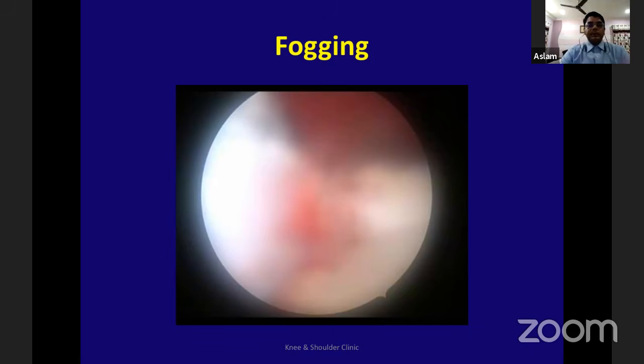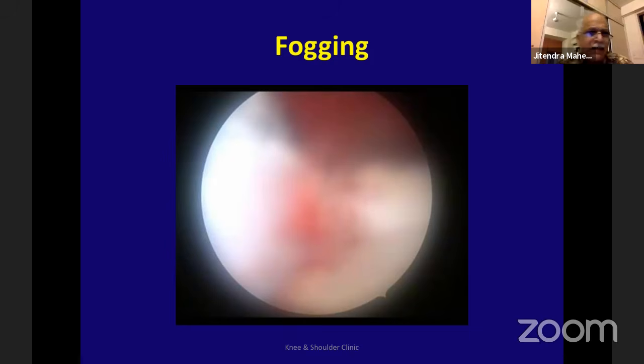The other part is about the locked meniscus. Once there is a locked meniscus, it does obstruct because sometimes there is a flexion deformity of 10, 15 degrees. When you know there is a locked meniscus, you can make your initial portal slightly higher. If it is a medial meniscus, it doesn't need any change; you can go through the same portal, except that when you enter, you will not see what you're expecting. You will not see the medial condyle of the femur or the medial meniscus border, because it's all displaced in the notch.